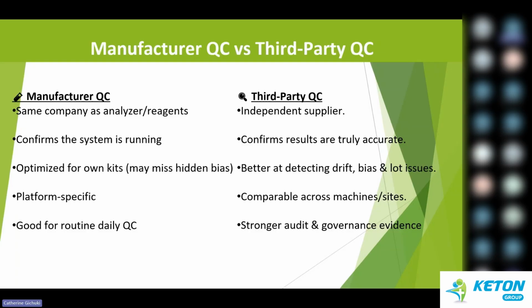Then the third-party QCs, on the other side, are comparable across platforms and across other sites. Usually the manufacturer's QCs are good for routine daily QCs. On the other side, third-party QCs provide stronger audit and governance evidence. When you want to provide evidence in audits and governance, maybe in management reviews, that is where it really makes a point.